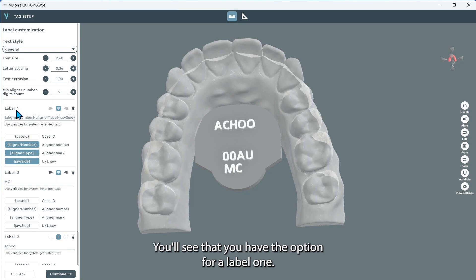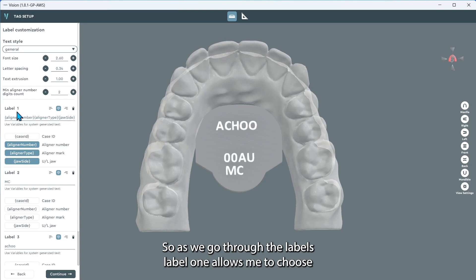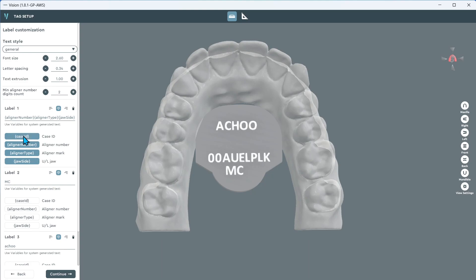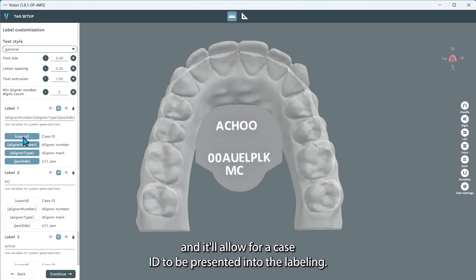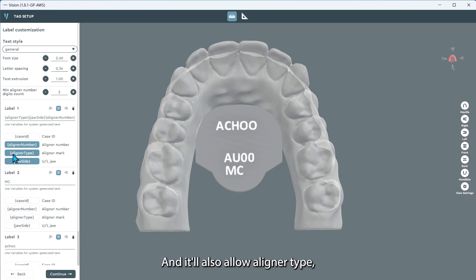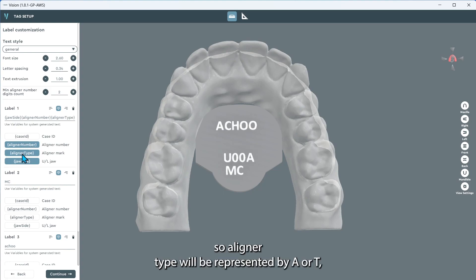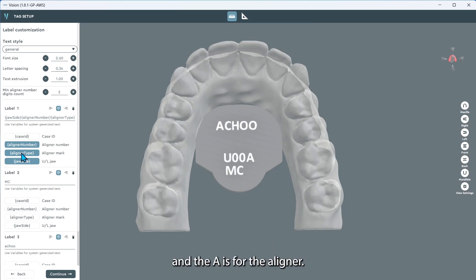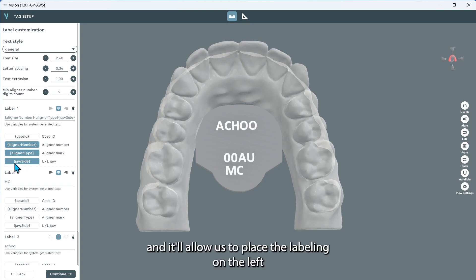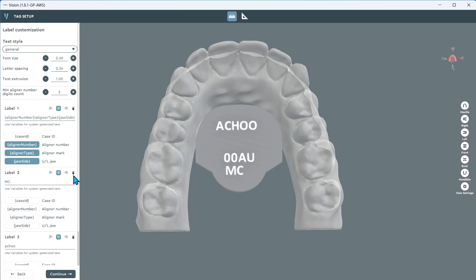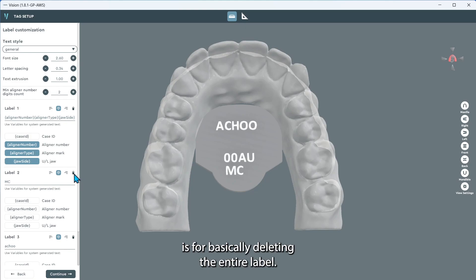You'll see that you have the option for label one. As we go through the labels, label one allows me to choose from the preselection available — I just have to activate the cell. It'll allow a case ID to be presented in the labeling, the aligner number such as 01, 02, and so forth, and aligner type. Aligner type will be represented by A or T: T is for a template for your attachments, and A is for the aligner. It'll also allow for the jaw side — U for upper and L for lower — and we can place the labeling on the left side, right side, or center of the fixture. The little garbage can icon is for deleting the entire label.